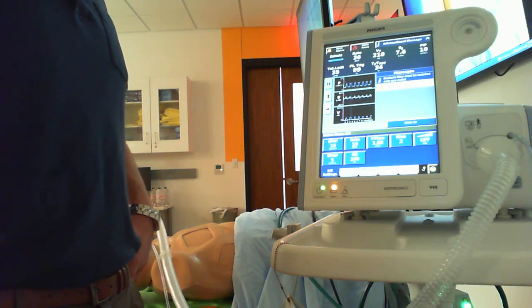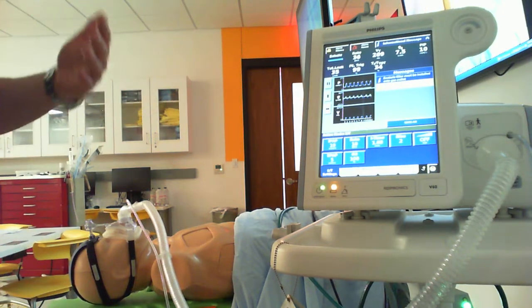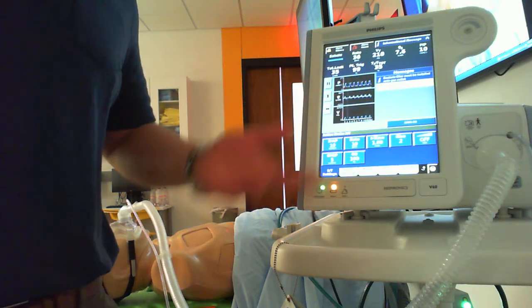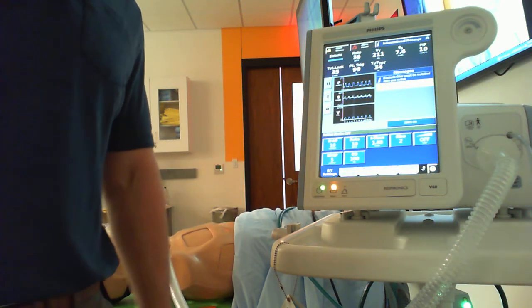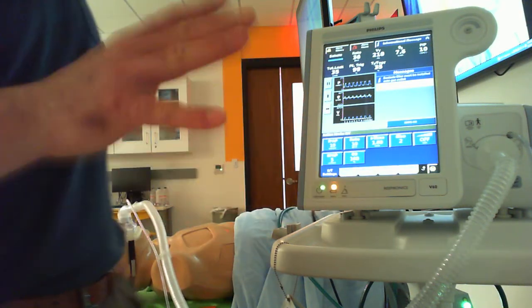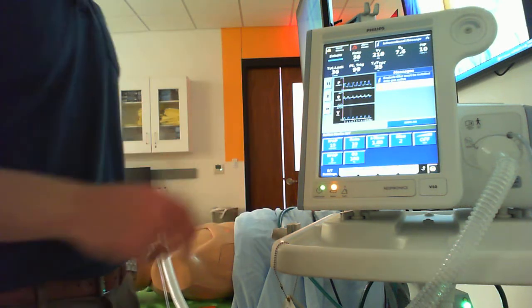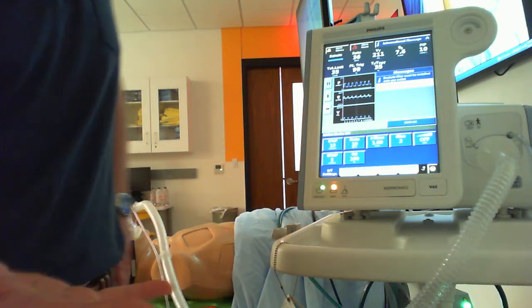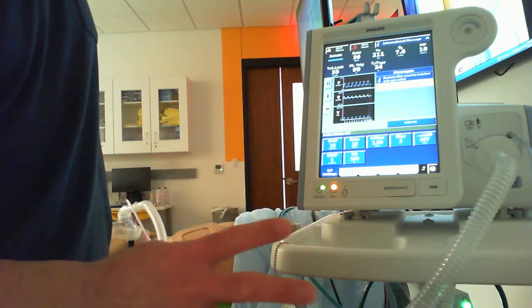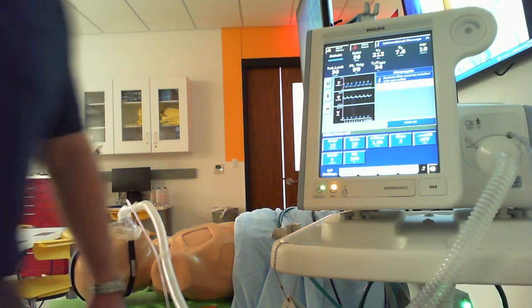Sometimes we're in the middle of stuff and just trying to get them squared away. So to generalize, I'd say most of our adult patients that are normal sized, we'd like to see them well above 300 milliliters, as we start getting up on really tall patients, up in the 400s and things like that. So if you can get a tidal volume around that 350 to 400 mils, that should be safe and appropriate for most adult patients. And then we can refine depending on what's going on with those settings and how big they are. So let's say this guy is 70 kilograms. If we're trying to give him 6 mils per kilo, 70 times 6 would be 420 mils. So that should be our goal tidal volume here, okay?